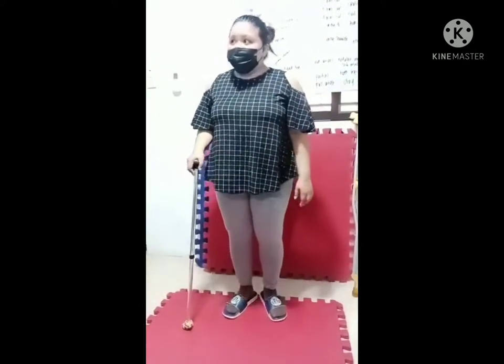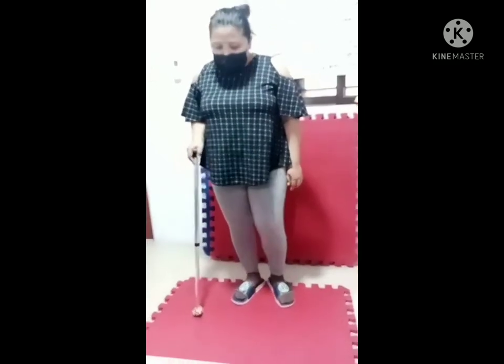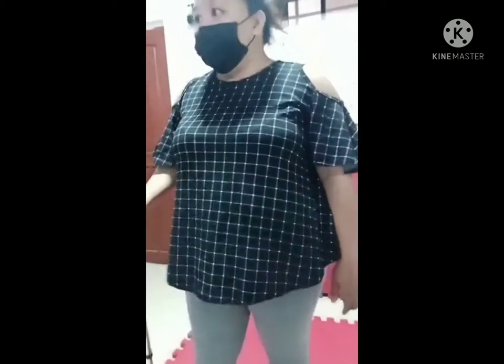We have two gaits. For the two-point gait: cane plus bad leg, then good leg. Cane plus bad leg, then good leg.